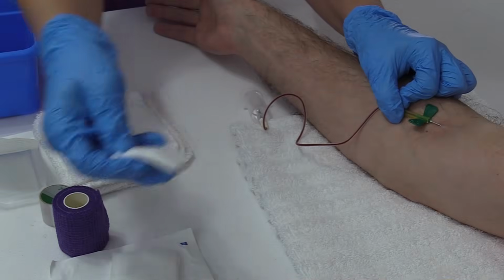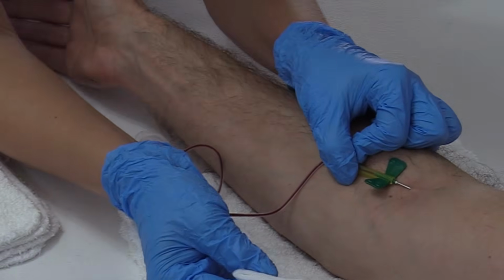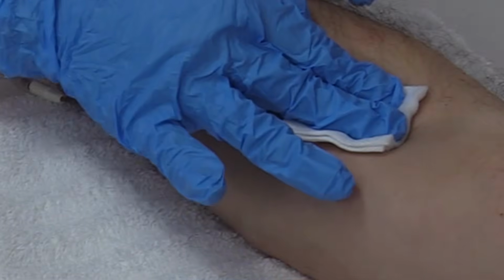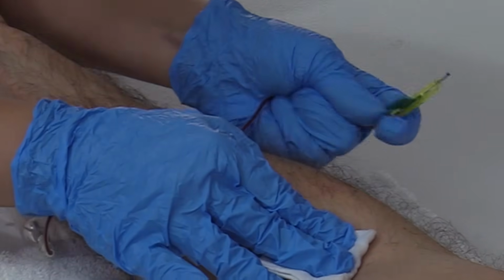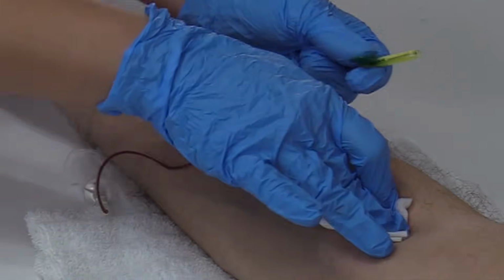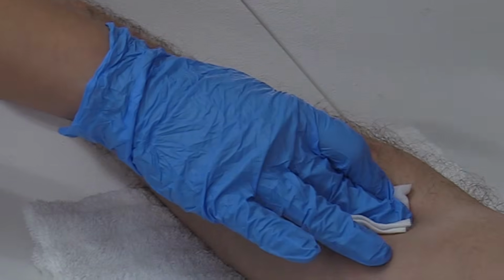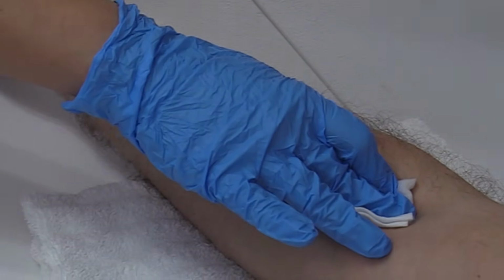So I'm going to take some gauze and I'm going to quickly remove the needle and then put the gauze on because I don't want to get a needle stick. So I'm removing a needle, holding pressure, and then I'm going to engage the safety on my needle by sliding that forward. Now I'm going to hold pressure, and this tubing, the needle, and the holder all go in the sharps container. So we'll put that in the sharps, and we're going to hold pressure.